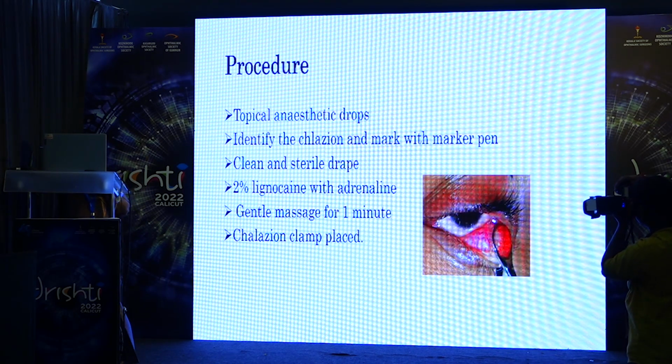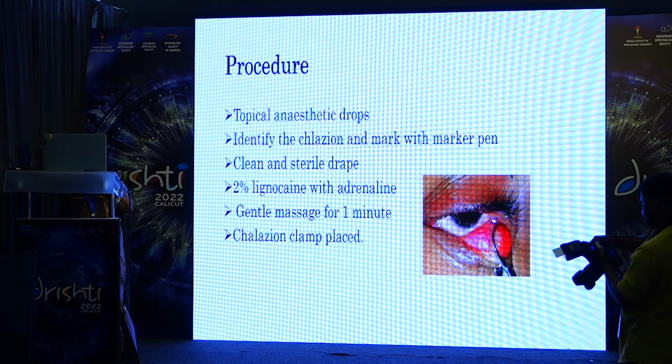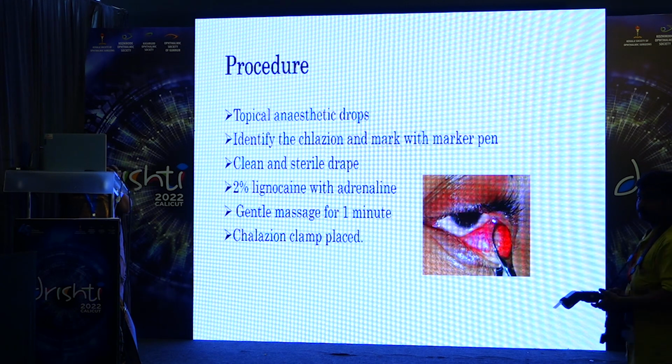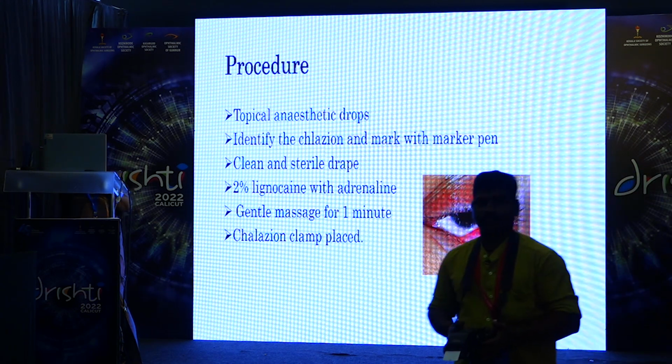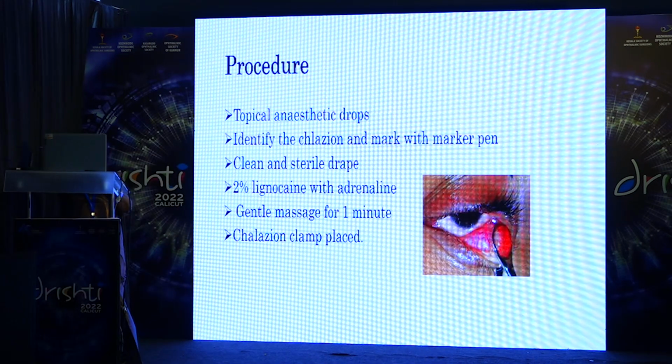Now coming to the topic proper, first you have to instill the topical anesthetic drops and identify the chalazion and where it is exactly located. You can mark it with a pen. Then clean with the povidone iodine solution, and after sterile draping, 2% lignocaine with adrenaline can be infiltrated subcutaneously in the cutaneous approach. Then gently give a massage for 1 minute.